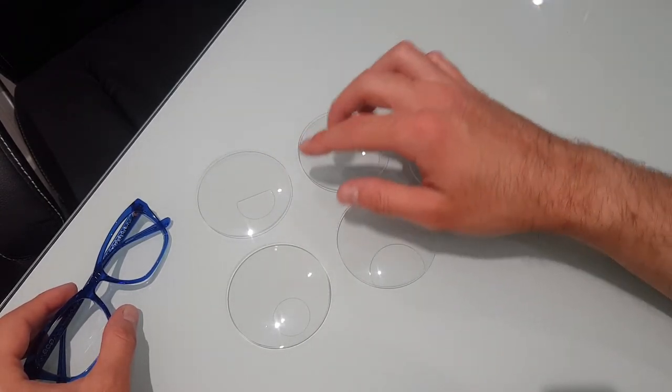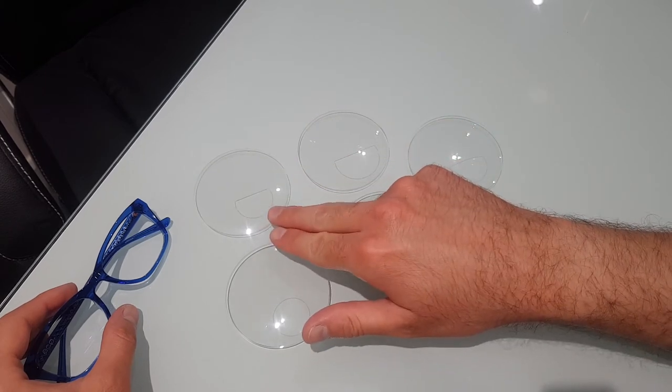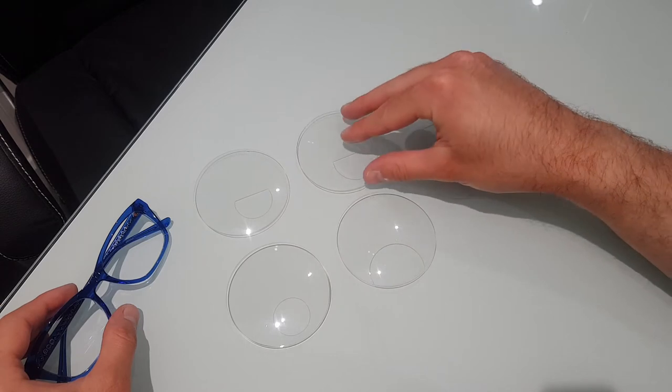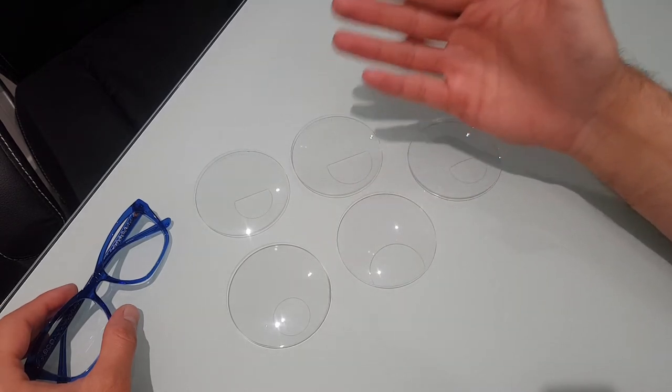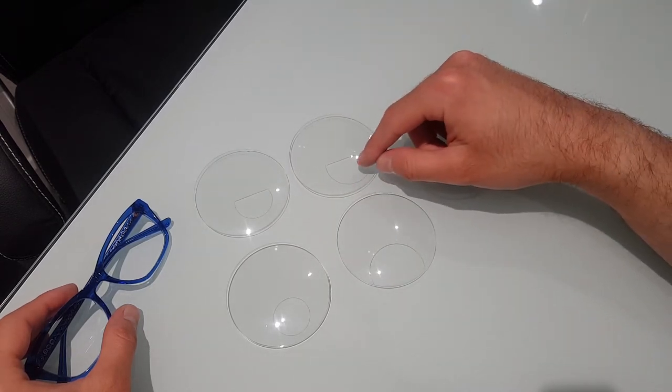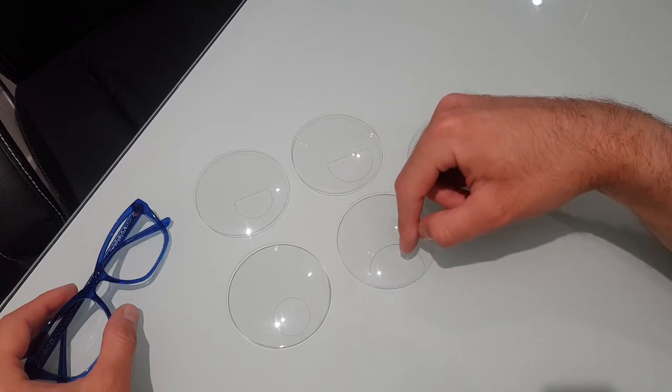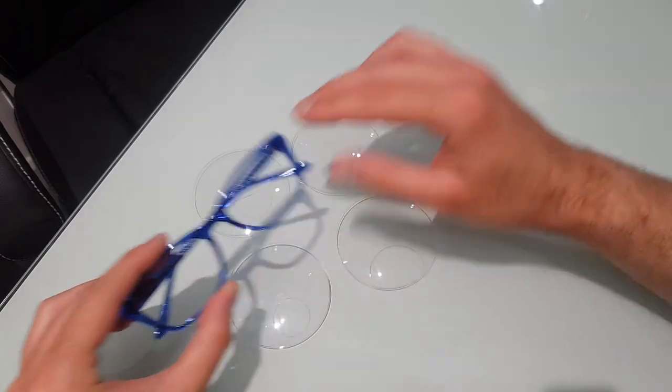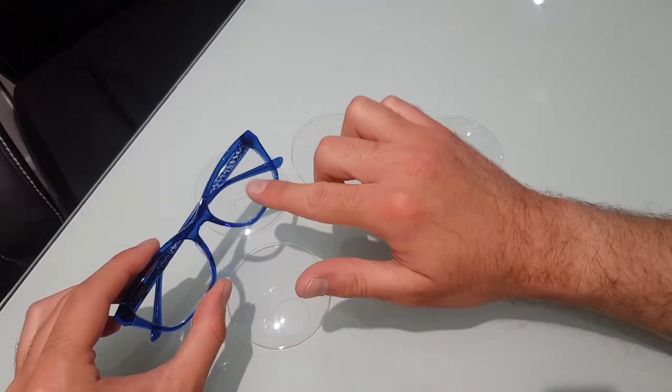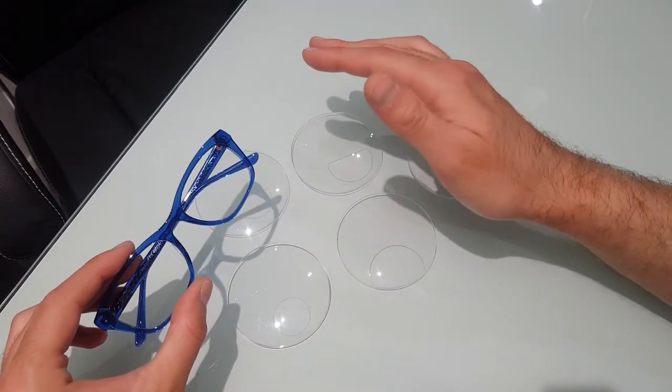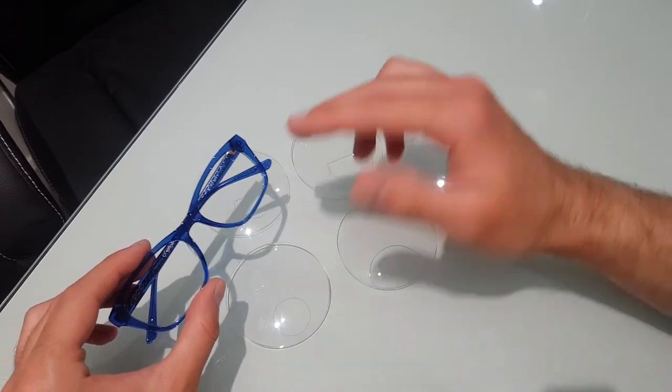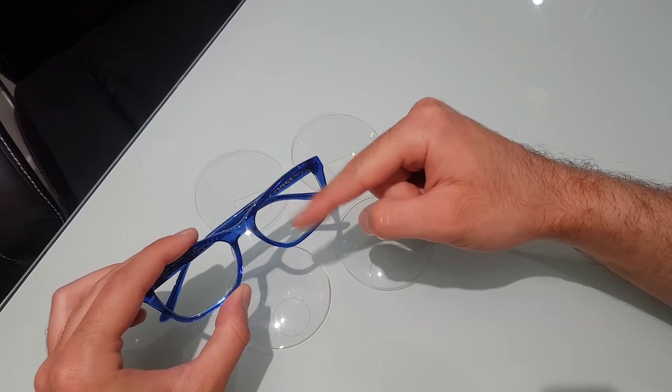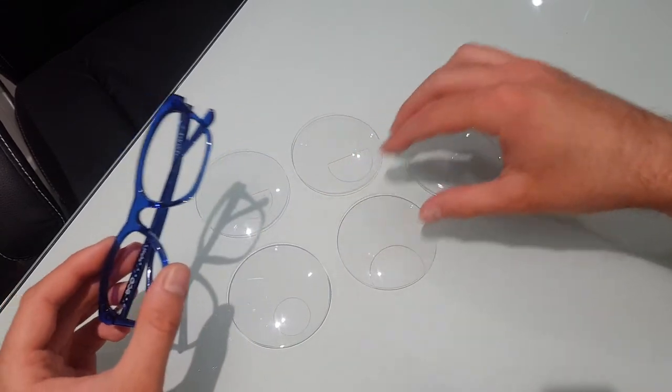One thing to bear in mind is that a lot of people would think, I want a much bigger reading area because I do a lot of reading. Let's go for a D35 or a round 38. They might not necessarily actually give you much more reading. It's all to do with where these lenses sit in your frame, and that is all dependent upon your personal measurements, your pupil distances, how wide apart your eyes are, and whereabouts your eyes sit in the frame vertically as well.